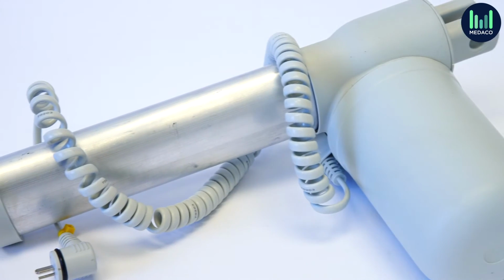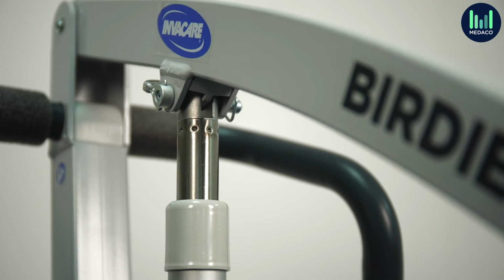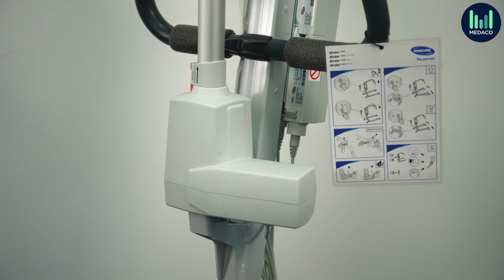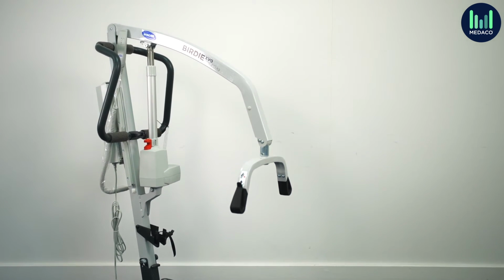Electronic components on equipment can cause issues in care environments. On mobile hoists, the electronic components that cause issues include the actuator and the control box. Some mobile hoists will have more electronics such as a powered lift, powered cradle and powered legs, which mean more parts have the potential to go wrong. Proactive service and maintenance checks, as well as taking good care of your mobile hoist in between these checks, will reduce the likelihood of electrical issues occurring.